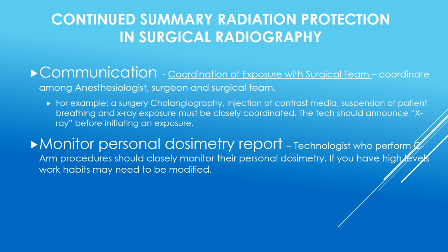Continued summary, radiation protection in surgical radiography. Communication, coordination of the exposure with the surgical team. Coordinate among the anesthesiologist, surgeon, and surgical team. For example, in a surgical cholangiography, injection of contrast media, suspension of patient breathing and X-ray exposure must be closely coordinated to get a great image. The tech should announce X-ray before initiating an exposure.